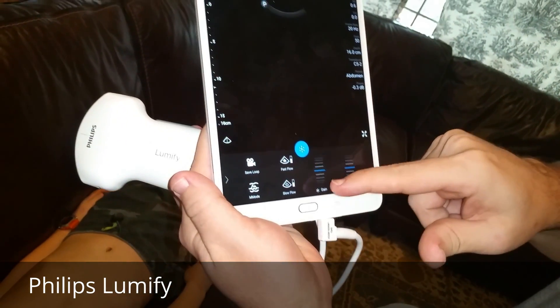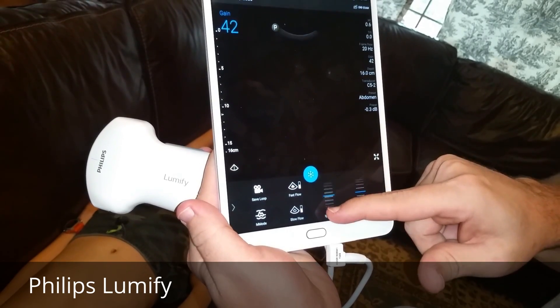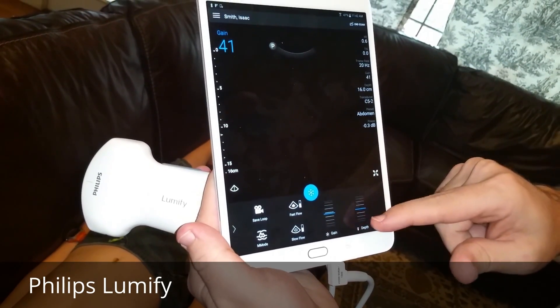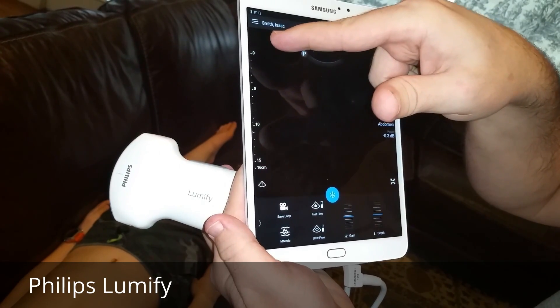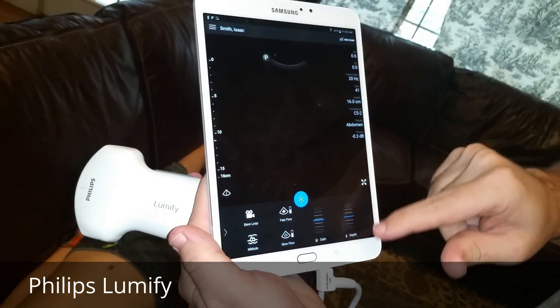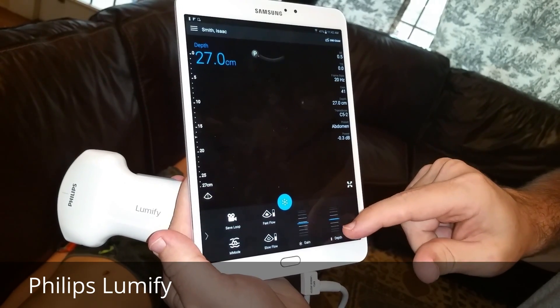Down here you've got your gain — you can see a little hand icon there that makes the image darker and lighter. And then depth: on the left you can see how deep you want this thing to penetrate, from 0 to 15 centimeters. If you want more depth you can just scroll down this little bar — pretty straightforward.